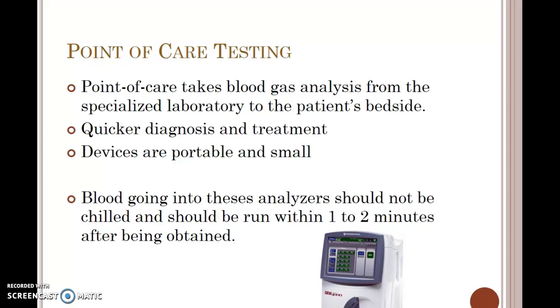So if you're using a point of care testing system, University of Iowa uses one, I know for sure, you do not chill those blood gases. They cannot be chilled, and you're also going to run them fairly quickly, so there's really no reason to have to chill those blood gases.